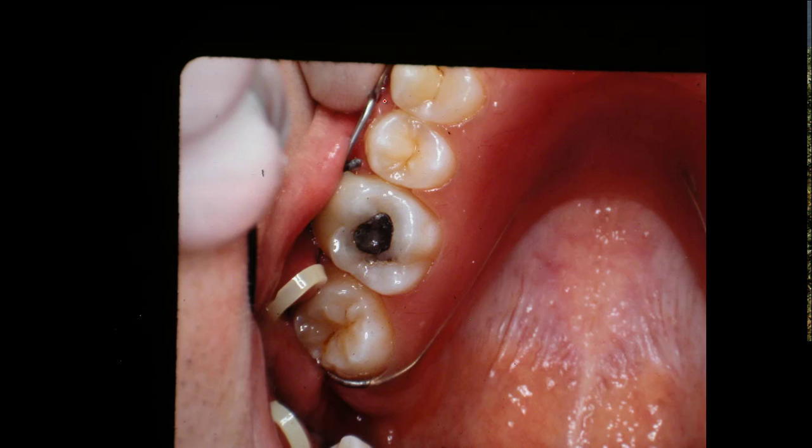All right, this is the retainer in there. Here's that composite, just a little wedge of composite. You got your tooth or something like that, the wire, something here, and we just build this composite right here on the tooth, and we put the retainer in and etch that and put that acrylic in it. On one side, you hook it up. On the other side, just bring it up over the wire and hook it, and then take your retainer and come over here, and then you have to pull this retainer wire out a little bit to snap it over this acrylic, you see. And then that retainer, it'll stay in like mad. I mean, you can pull on this elastic all you want to, and it won't pull the retainer out. It'll pull the maxilla forward now while you're doing that.